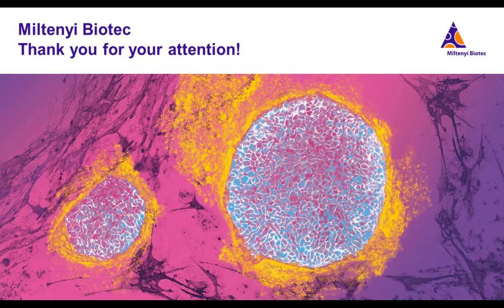So you can use it for basically any tissue type. So we have tested basically any kind of solid tissue, tumors, and so on and so forth. The most important thing is it is only restricted to fixed specimen.